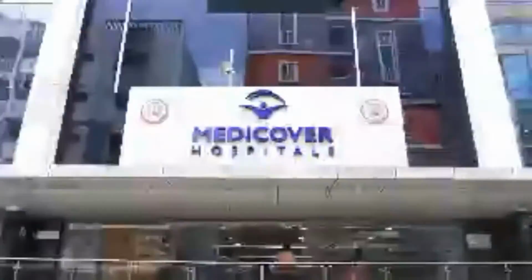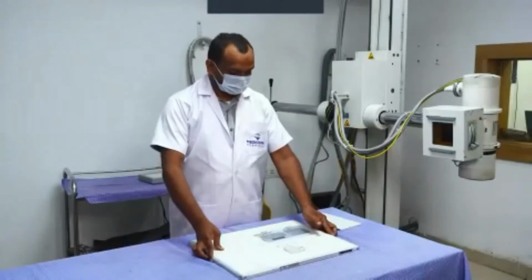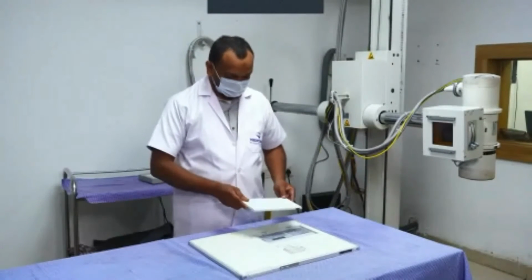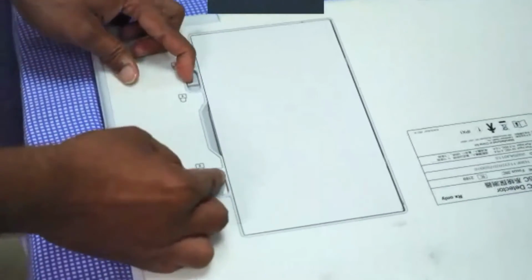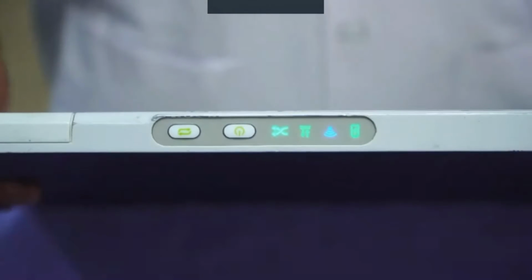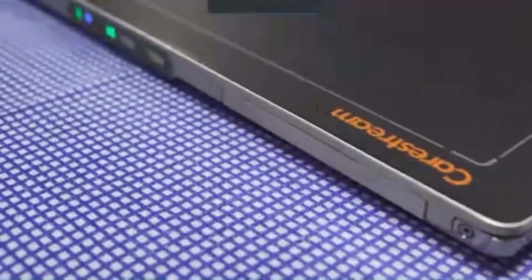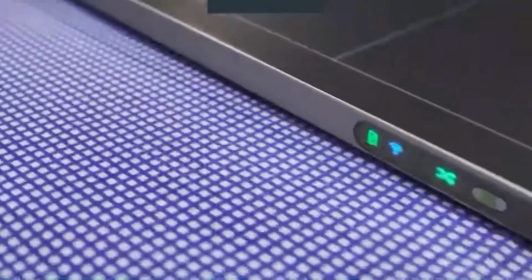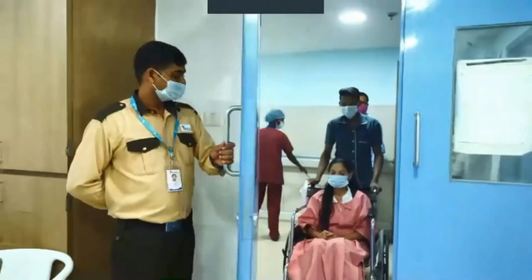Yeah, this is our hospital, Medicover Hospital, located in Hyderabad city of Telangana state. That's the reception you could see. That's the detector, the focus detector. You see my technician is handling the detector there and he's placing the battery there. You need to charge this battery regularly. And that's the focus 35C detector, which is of high quality, and you can see all the indicators and the switches over there. And a 3.3 kg lightweight cassette, which is easy to handle. You could see that there's a Wi-Fi indicator shown there, and the charging, how much is charged.